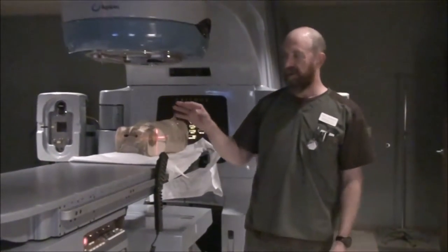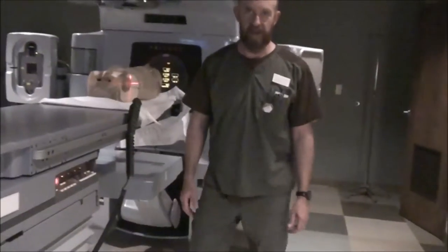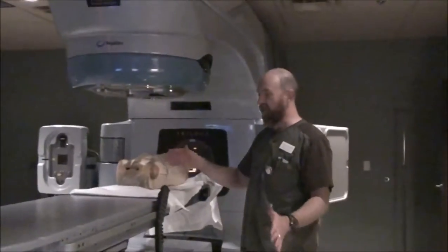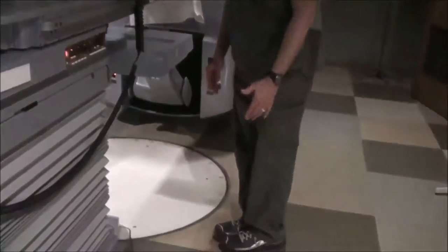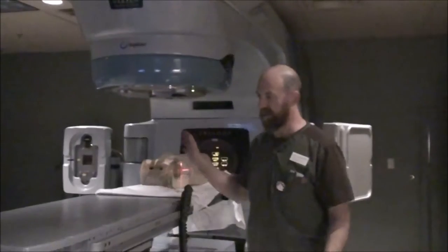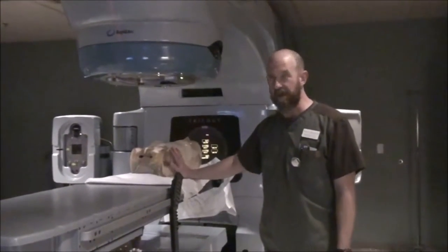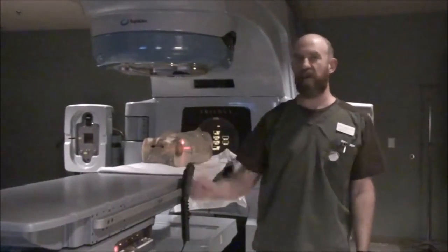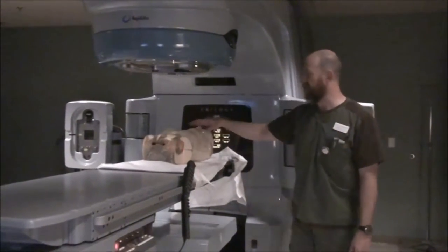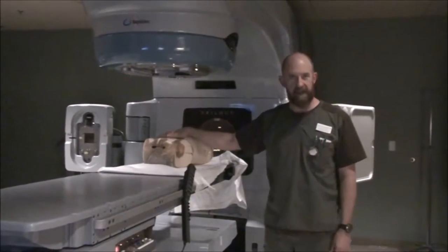If you have the feet unbound on a knee rest, then everything moves independently. If you have the feet locked into place, nothing moves independent of the hips. From the hips, knees, and feet will stay all one unit, and it will become more reproducible on a daily basis. So make whatever immobilization device you're going to make. Make sure the hands are up on the chest — you don't want to have the hands on the abdomen.